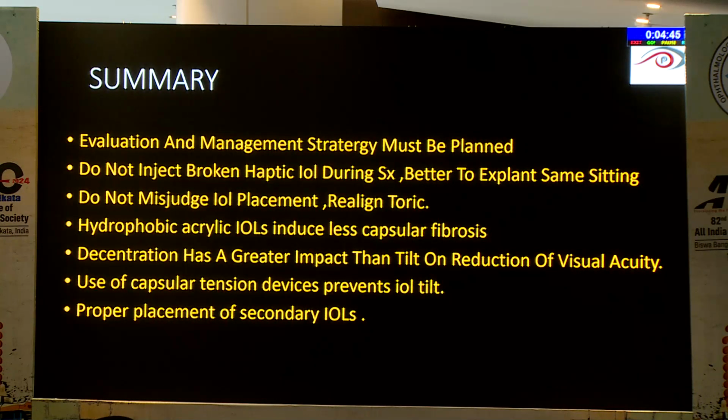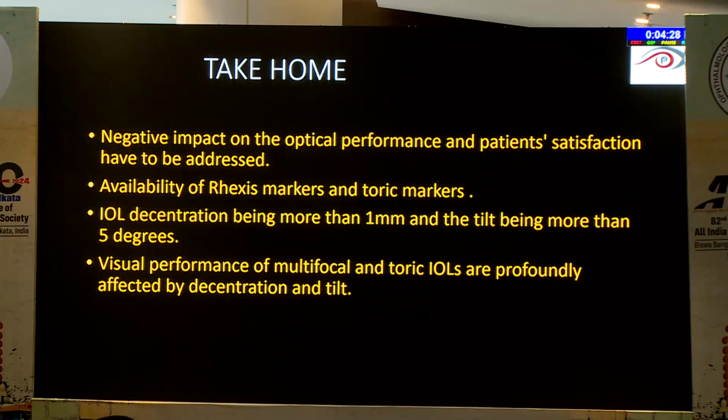So in summary, the evaluation and management strategy must be planned. Do not inject your broken haptic when you can already see it and can explant it then and there. Do not misjudge your IOL placement also. Decentration has a greater impact than tilt on reducing your visual quality. Proper placement of your secondary IOL also is very important. My take-home message would be that the negative impact on the optical performance and the patient satisfaction is equally important.